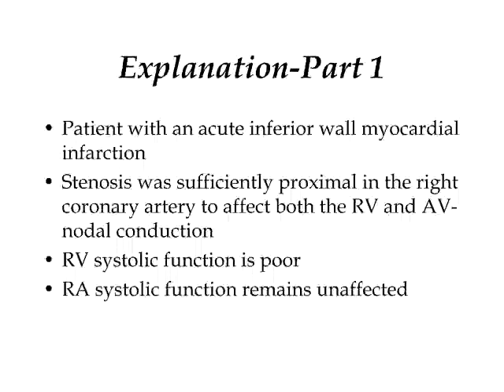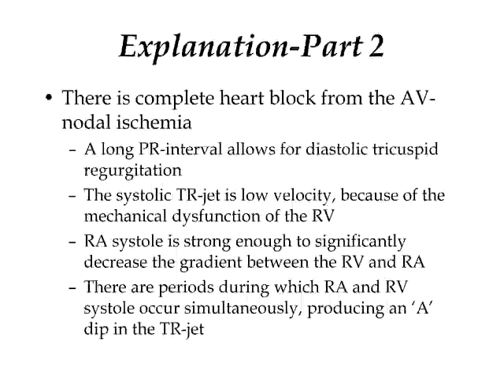This is a gentleman who came in with an acute inferior wall myocardial infarction, and his stenosis was sufficiently proximal in the right coronary artery to affect both the RV as well as conduction through the AV node. His RV systolic function is poor; however, his right atrial systolic function remains unaffected. Because the AV node has become ischemic, he has complete heart block, and the bright echodensity in the echocardiogram is that of a temporary pacemaker.